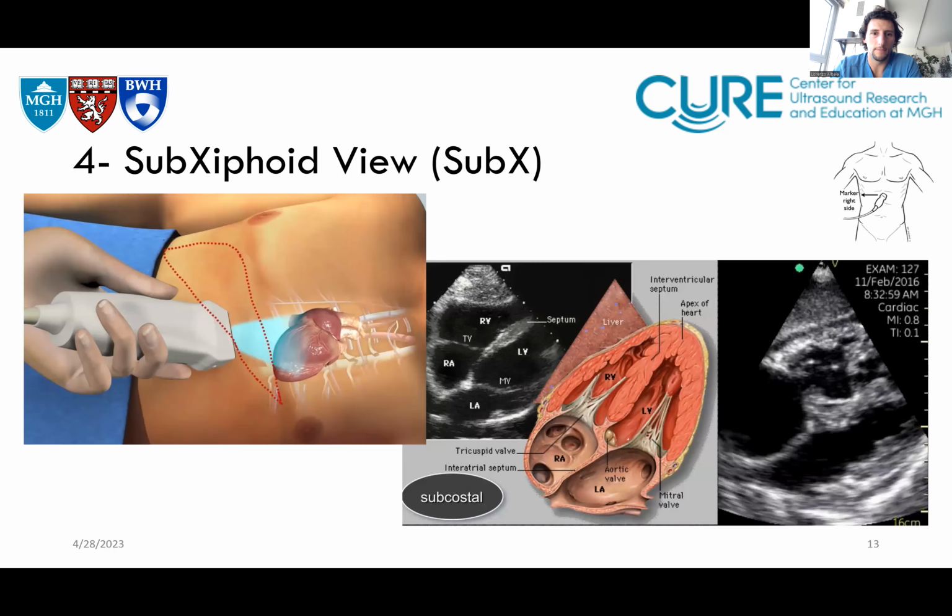Your subxiphoid view is the fourth component. Now you're just moving the probe more to the midline. People don't really get how much pressure you sometimes have to put in here. It's kind of uncomfortable for the patient, but I like to change my hand to an overhand grasp. In this image the person is not doing that, but if you flip the hand over top of the probe, you can flatten the angle of the probe even more and push it so it's looking under your xiphoid process.